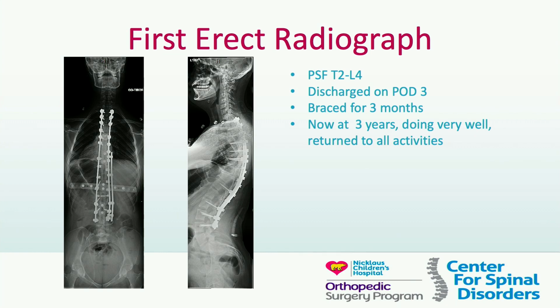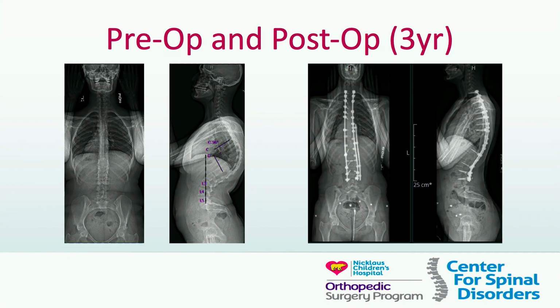Again, the question is, do you need navigation for a case like this? Perhaps not. But what I can say is that there is a level of predictability and reliability that you get going into a case like this where doing it freehand would not allow you to have. So for that reason, I do think it impacts your ability to treat that patient.